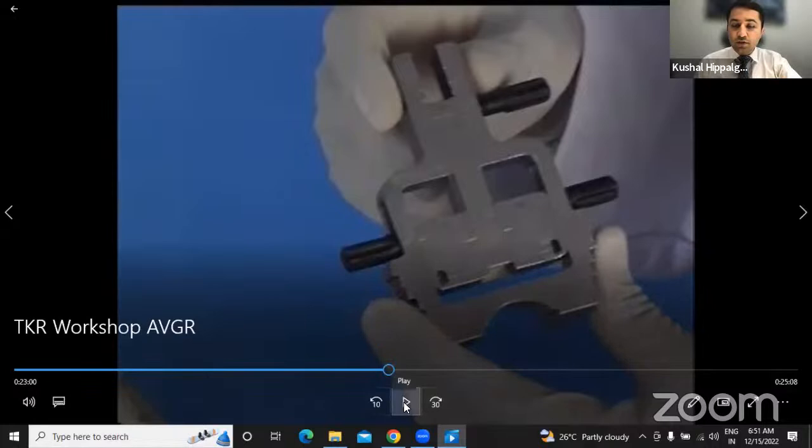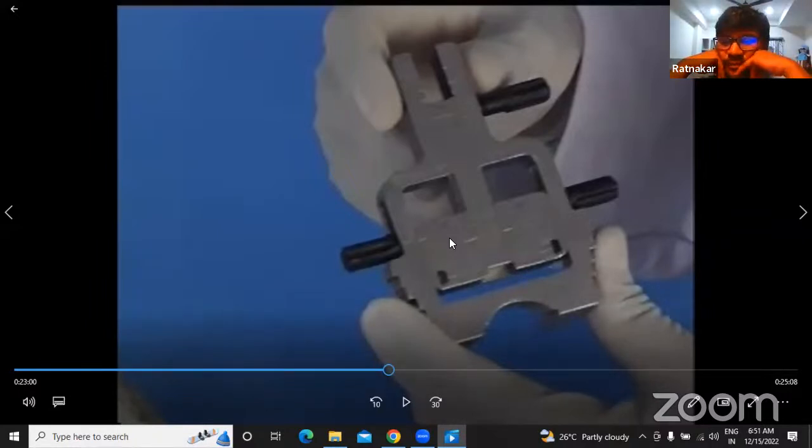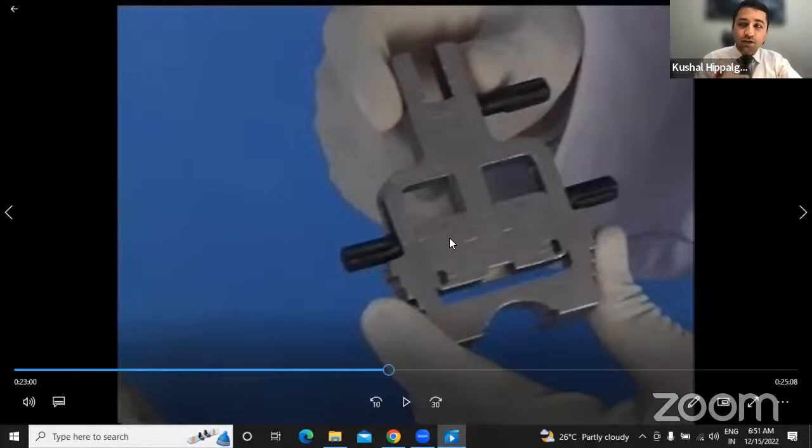Another point is regarding the play which is there in the saw and in all these jigs. So you need to be careful how much you're cutting. It comes with practice, but in the initial stages, take a cut, go back, and look at whether you've cut to that particular level. Put the saw blade in again and see if you've reached that level. Don't just assume that the cut is done. That would save you from a lot of trouble in your early cases, if you ensure that the cuts are complete.